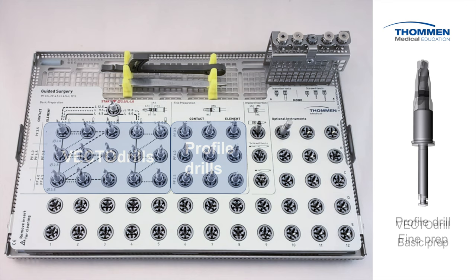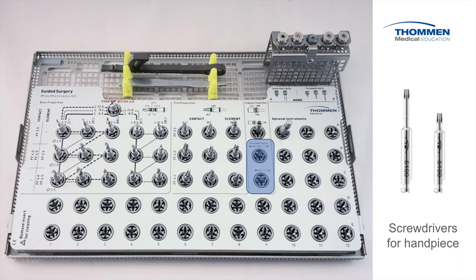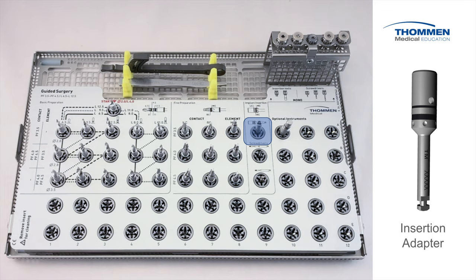Profile drills are required by all contact and element MC implants. Since the depth of placement with Toman implants is flexible, there may be times when profiling is beneficial due to deeper placement or dense bone. While profiling is depth controlled by the guide sleeve, every drill in the kit also has conventional laser markings to cover those unexpected clinical surprises. Two screwdrivers for handpiece are directly to the right, and the guided insertion adapter is just above. Take note of the laser markings on the instrument.